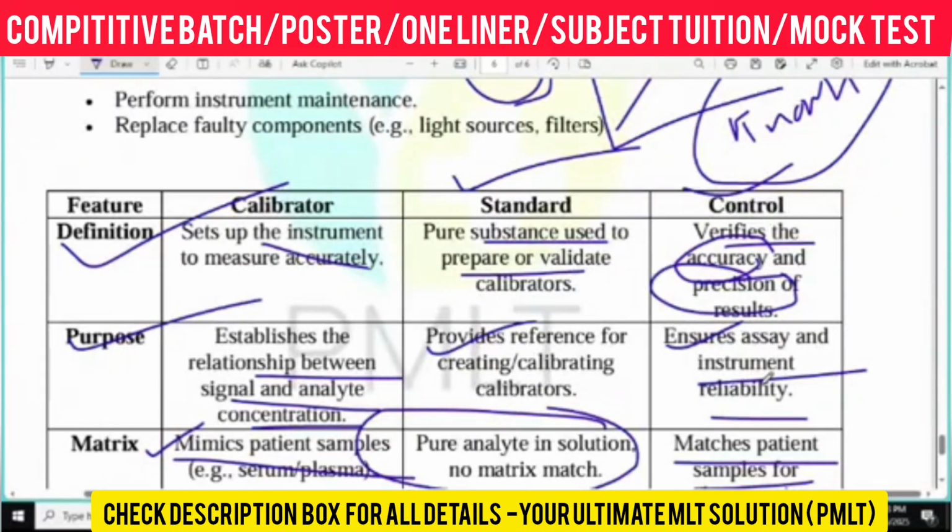I have already explained the whole thing regarding calibration, and I have also told you the extra things, that is, the difference between the calibrator, standard and control, so that you get the basic idea and can easily differentiate them. I have mentioned the differentiation here. Tell me, up to this much, any doubt?